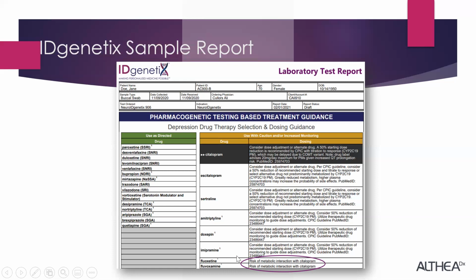That is followed by the drug-drug interaction piece that you see down here. However, in this section, we don't provide comprehensive information as to what to do with that information, because although there are two medications that have a drug-drug interaction, there may be a clinical indication that the patient can still be on both of them.